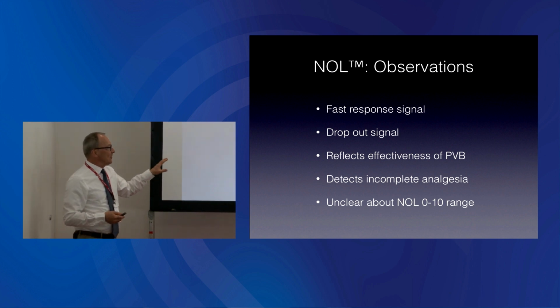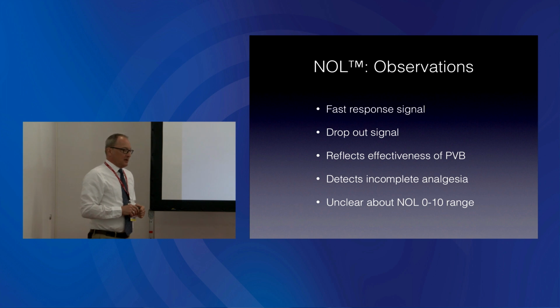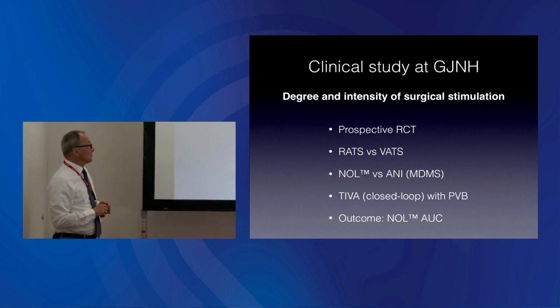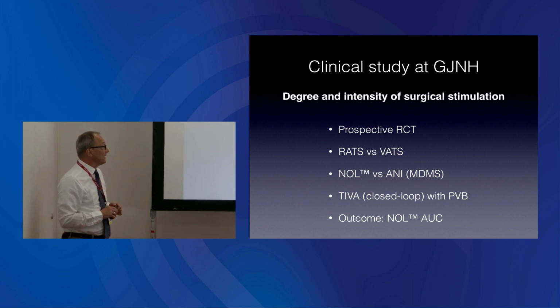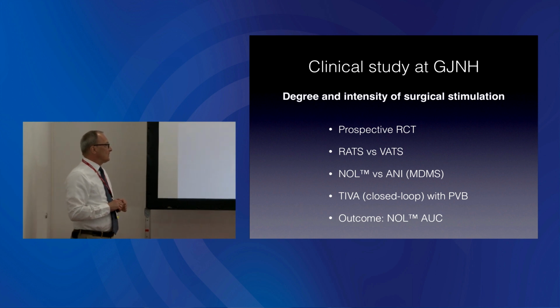But in my patients, I wonder whether the sympathetic block in itself is just creating such a pattern. And that's why we're embarking on a study. We will compare these in a prospective trial. We will also compare it with other nociceptive monitors, and we will look at what we see.